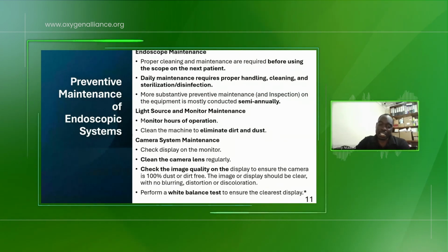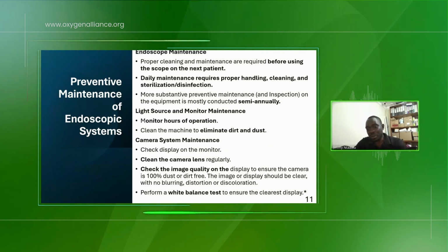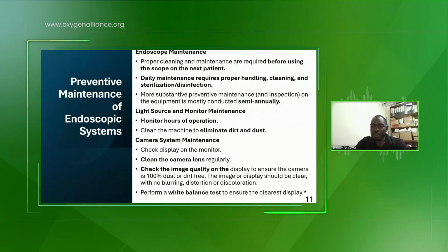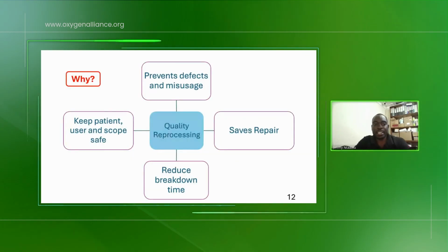Then we have those processors that do white balance. It's a technology that is wearing out, or most people don't use it. Some brands don't use it. That is what we call white balance, whereby you ensure that what is white is white, what is red is red, things like that.